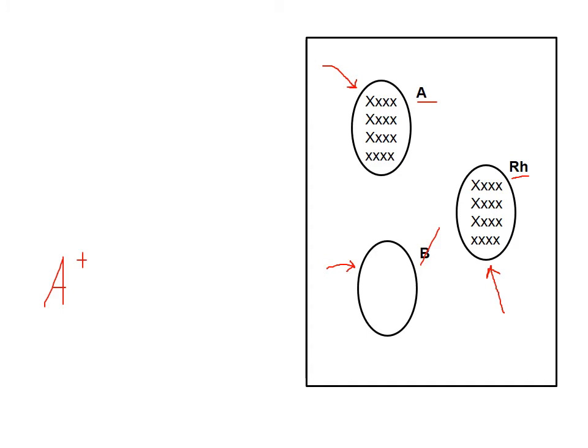I'm hoping you're following this. We make it so much more complicated. Again, there's only 3, and it's either is it there or is it not. If it is there, that means it's on the surface. If it does react, it's there. If not, it's not.